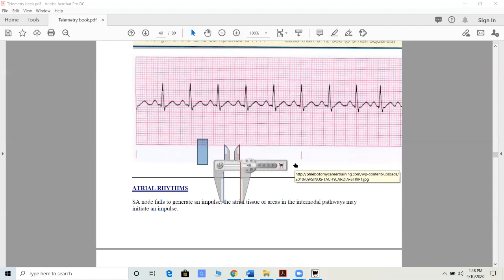And that is what you're going to find. The faster the heart rate goes, the more compressed your measurements are going to become. Our QRS is beginning to show it. Our PR hasn't really been affected by it too much, but the QT, absolutely. We are way below normal. We're at 0.28, 0.26, and 0.34 is normal.